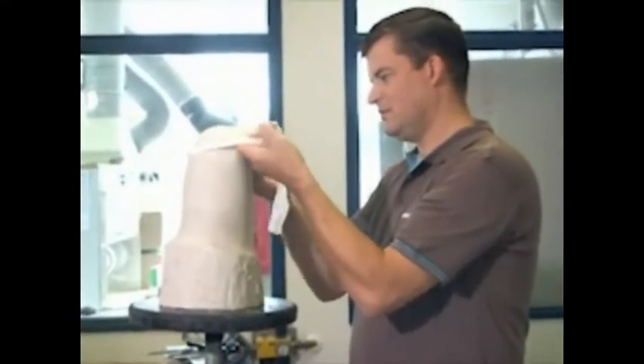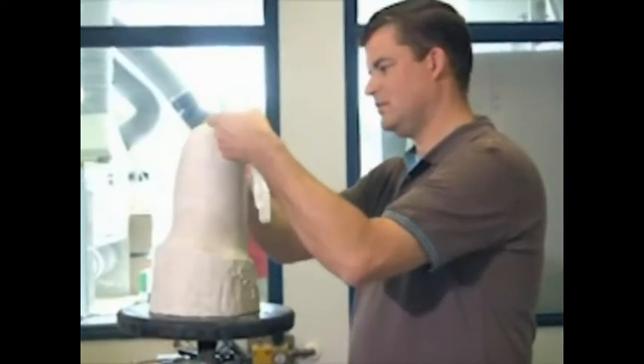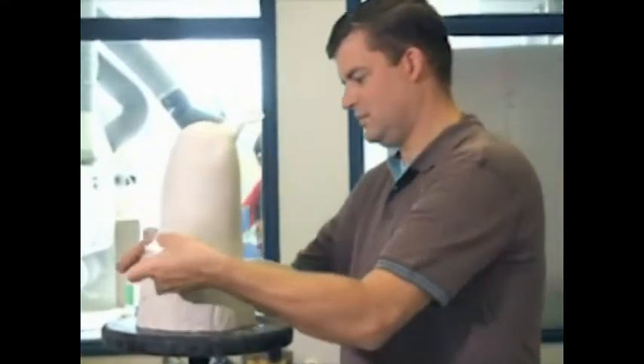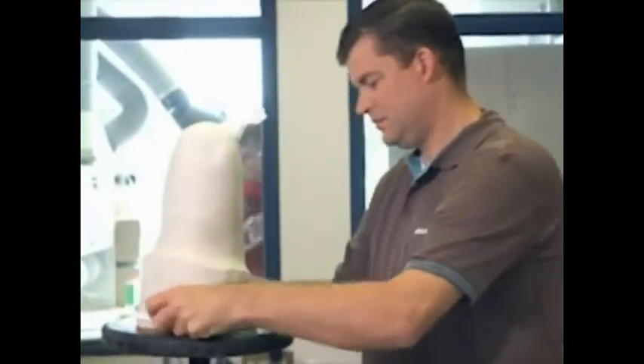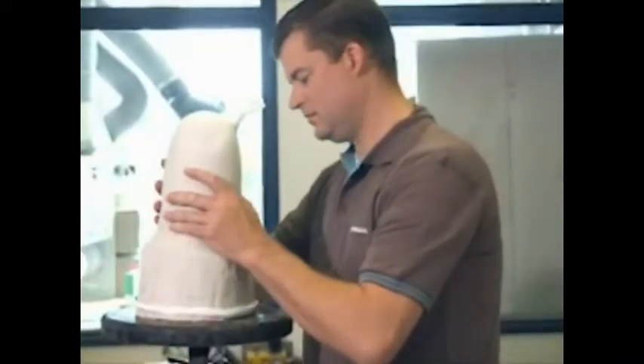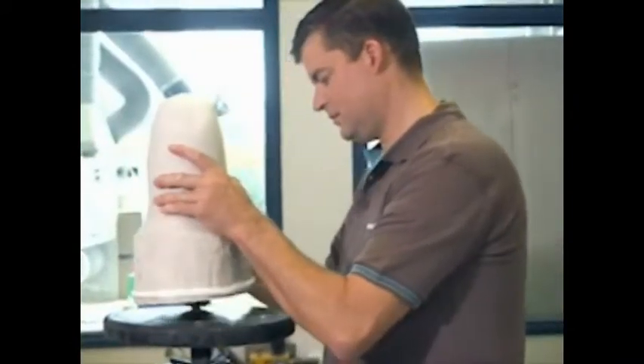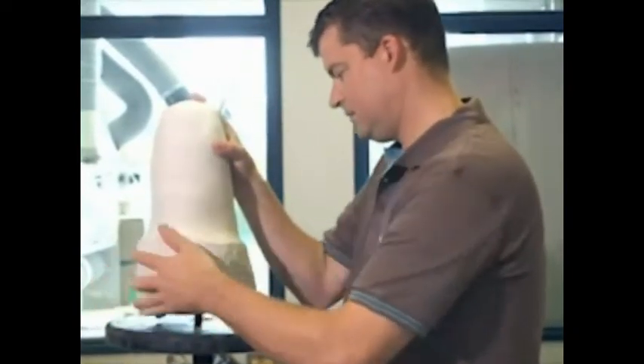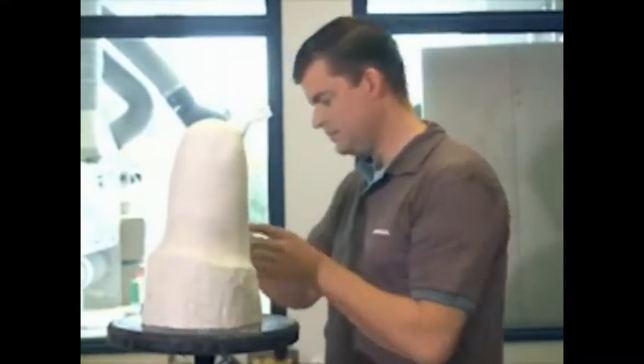Preparation for vacuum forming. Prepare the plaster positive with a thin 99 B25 Perlin stockinette prior to vacuum forming. Tie off the Perlin below the valve dummy.